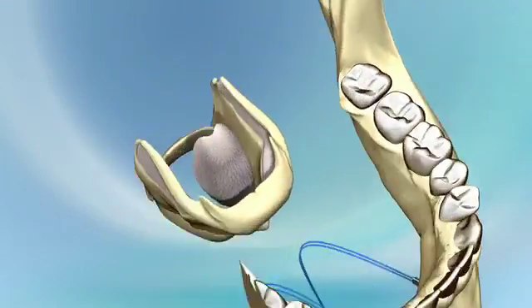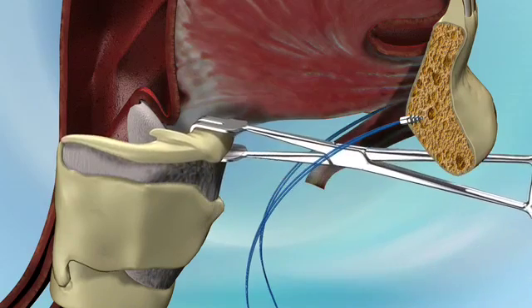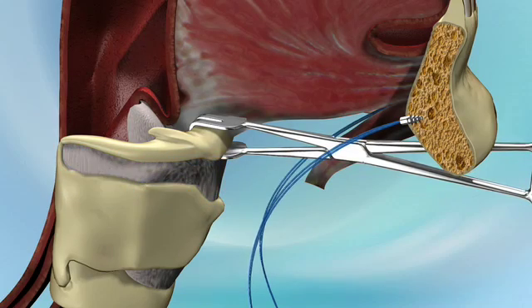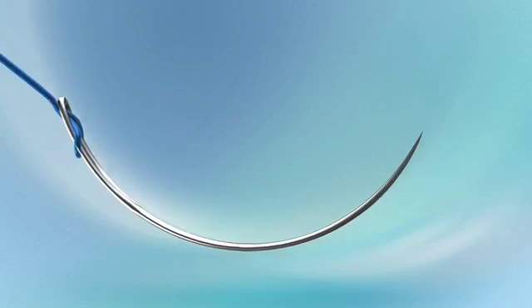A Leahy or Alice clamp is returned to the midline hyoid bone and the clamp rotated up toward the chin. This hyperexposes the inferior musculature, facilitating easier needle passage around the hyoid. A 1-inch free-curve needle is loaded onto one of the closed suture tail loops, forming a clove hitch.